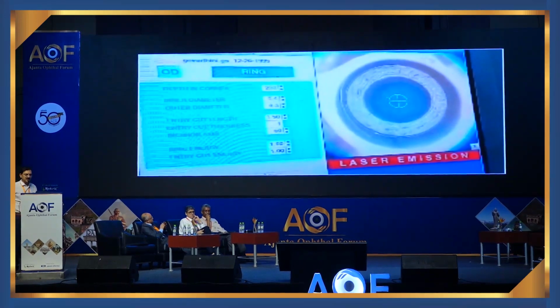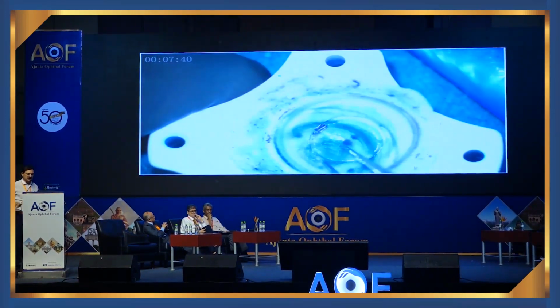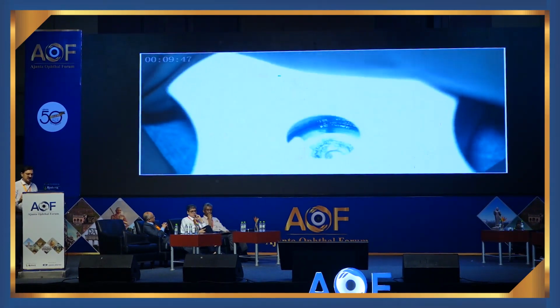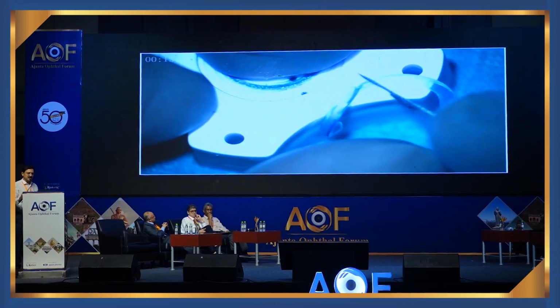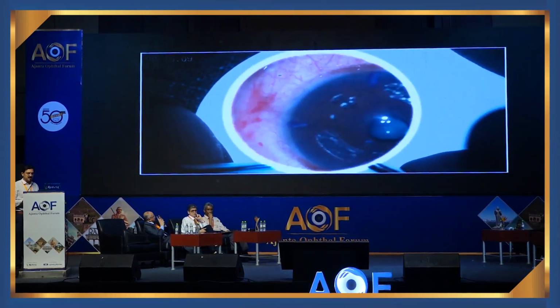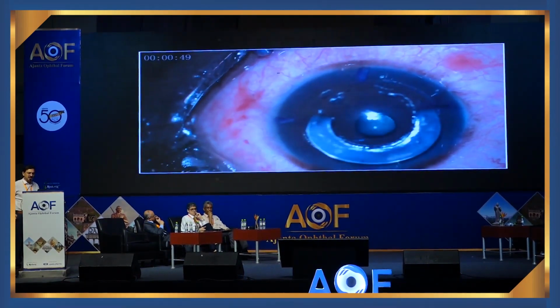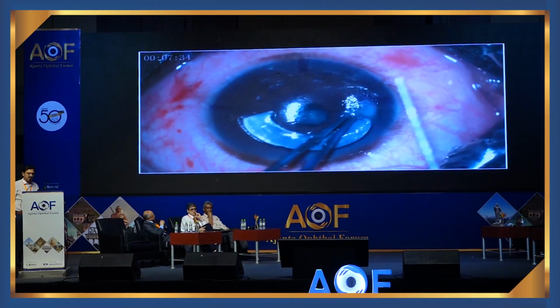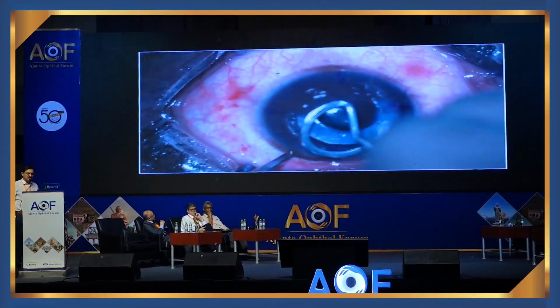So here we make in femto a 250 to 300 microns thickness tunnel. Then the central punch is usually 5 millimeters or 5.5 millimeters. Then the periphery again around 7.5 to 8 millimeters punch. Then we hand fashion posteriorly depending upon the topography. Usually I take only one cut and put the button and put the ring and push it into the segment.